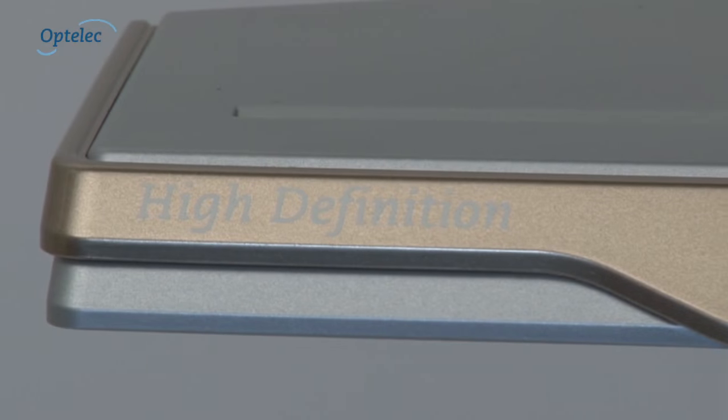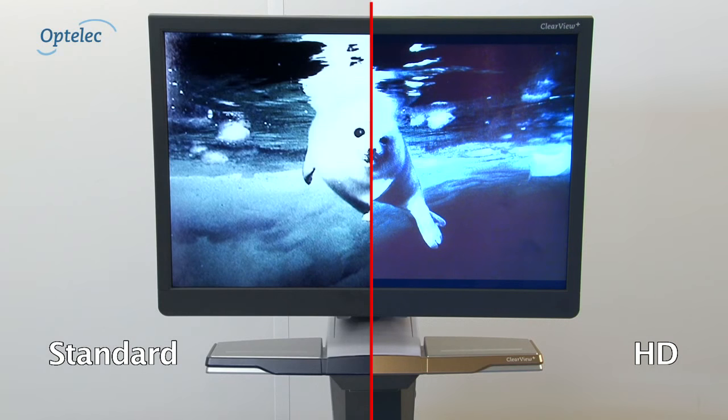Have you considered using an Optelec Clearview Plus with a high definition camera? Using the latest HD technology, it's possible to offer very low magnification and an overview of reading materials. Text appears smoother whilst images appear clearer.